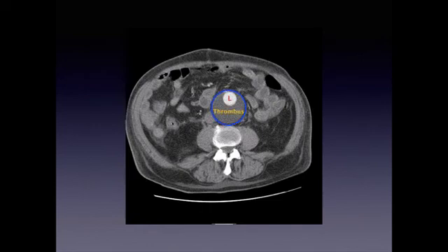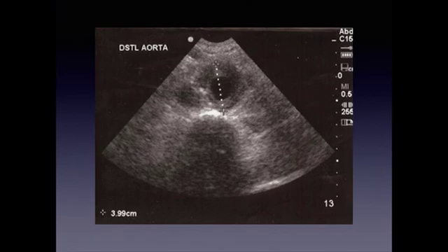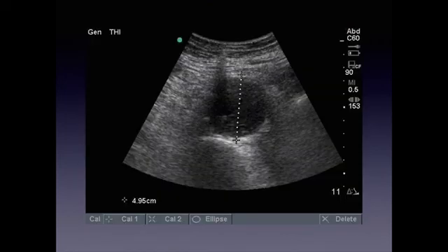That's a huge aneurysm. Again, same thing, thrombus circumferentially with lumen in the middle, but you want to measure the entire aorta. Same thing. How many times can we go over this? But it's the most important part of doing an abdominal aortic scan, because this is what you're looking for, an aneurysm, and you don't want to not be able to measure it correctly.